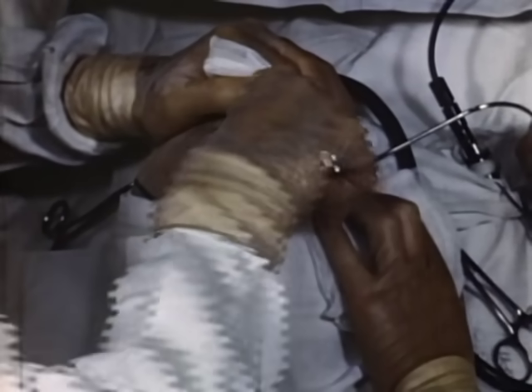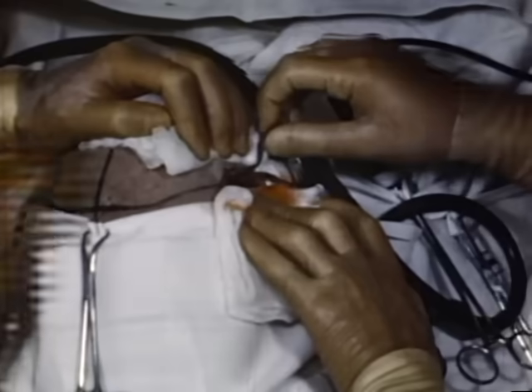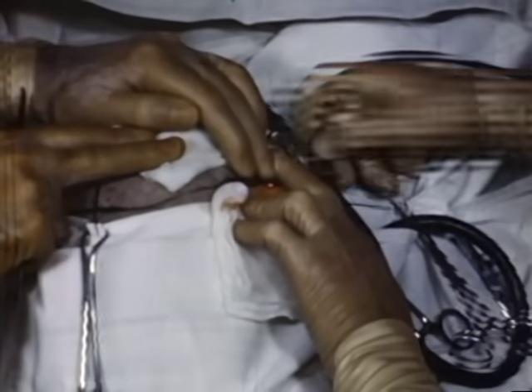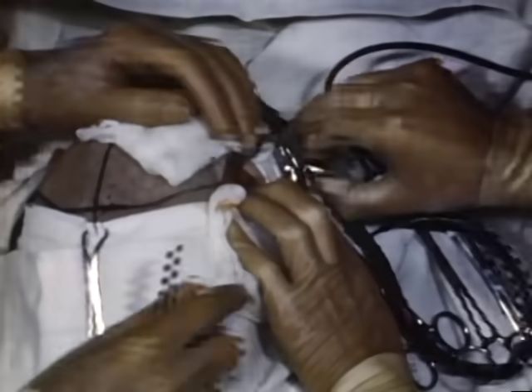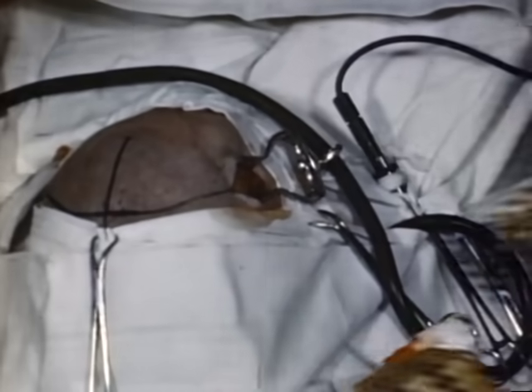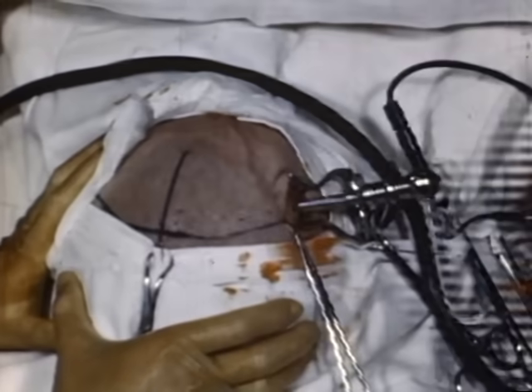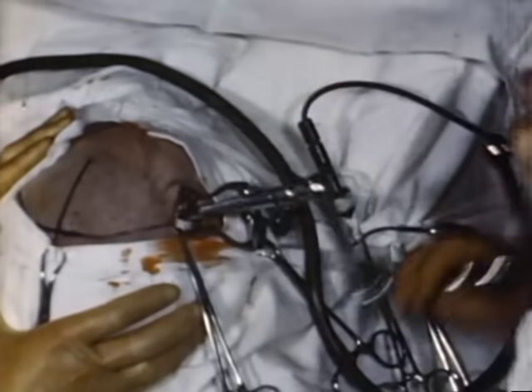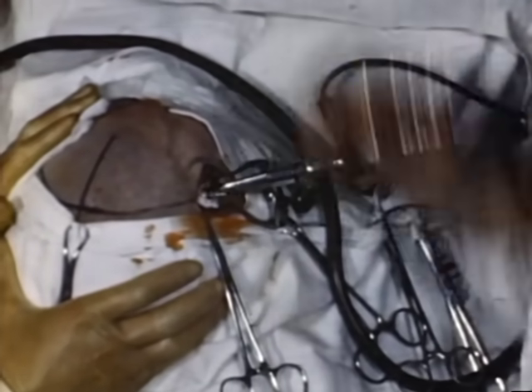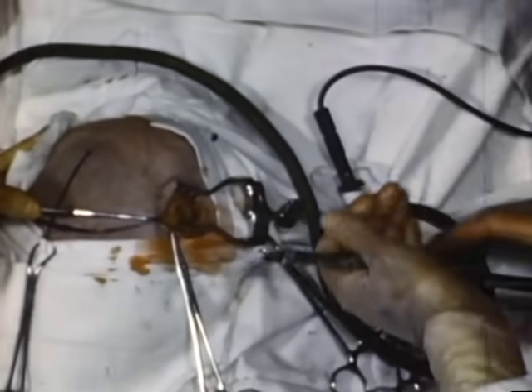The periosteum is scraped off and markings are made with a chisel. The wound edges are then retracted with a self-retaining mastoid retractor. A burr hole is placed in the coronal suture by means of successive drills. The opening is then enlarged in the line of the coronal suture by a rongeur to give greater play for the knife.